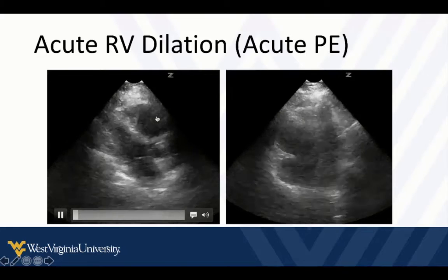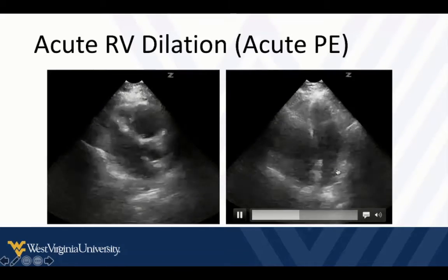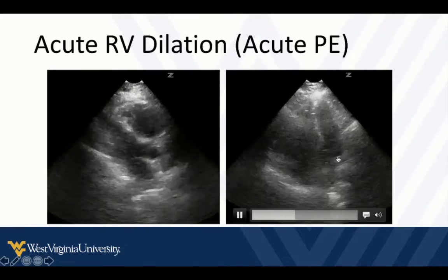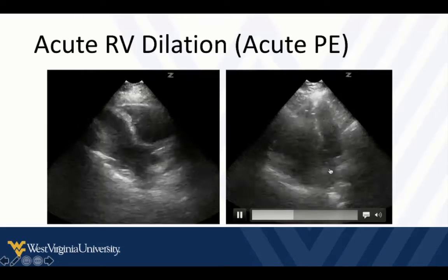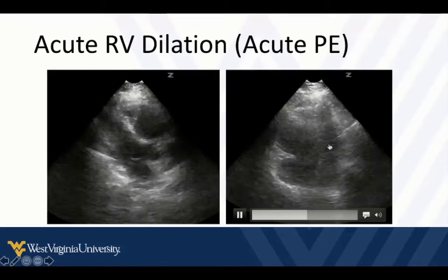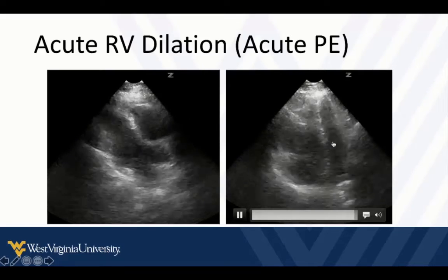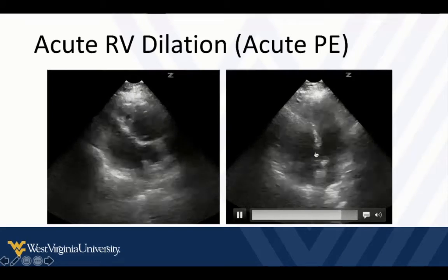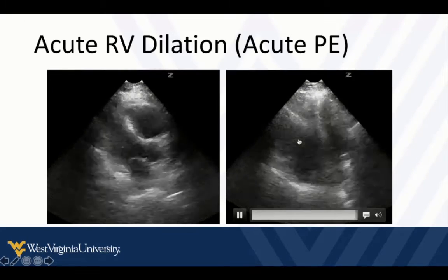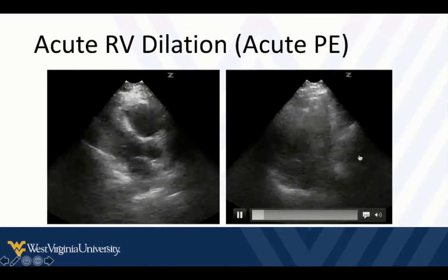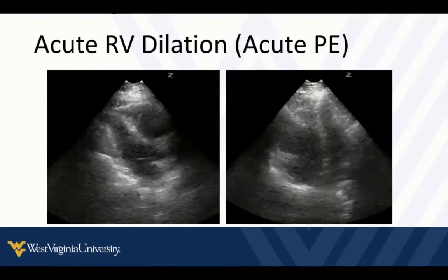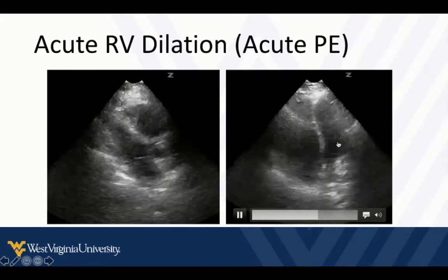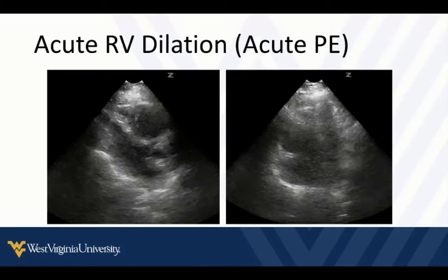In the apical four chamber view, to confirm it's an appropriate view, we can see pretty much the full length of the left ventricle, the full length of the left atrium, and the mitral valve. In this correct plane, the right ventricle is massively dilated. Knowing we're in the right plane gives us the clue that this is a true finding and not just an aberration of the probe's tilt or position. Sometimes I'll do a little rotation to make sure I'm seeing the left ventricle at its widest point.